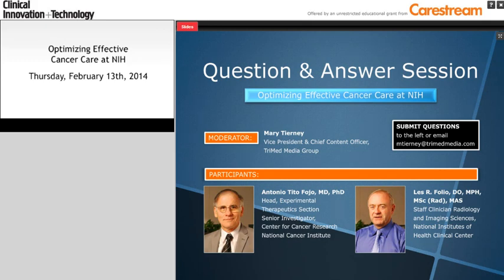Consultations, as Dr. Fojo mentioned, arise if we didn't measure the right index lesions because we didn't have the history, or because the radiologist was just doing the traditional, qualitative report we've been trained for. That consultation has a time cost, and we're trying to evaluate those time costs. Some are a little less tangible to wrap our hands around and measure, but we've seen a definite increase in our information processing, to the point where we've been able to justify hiring a radiologist dedicated to tumor measurements and 3D processing, while the traditional radiologist workflow continues without interruption. This additional radiologist has helped us tremendously.